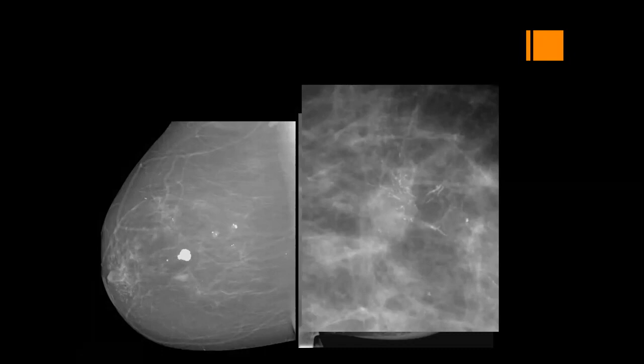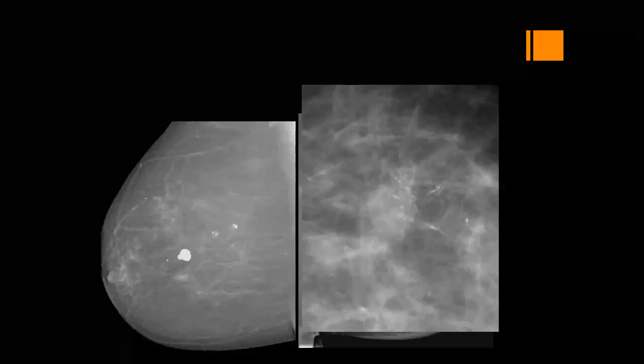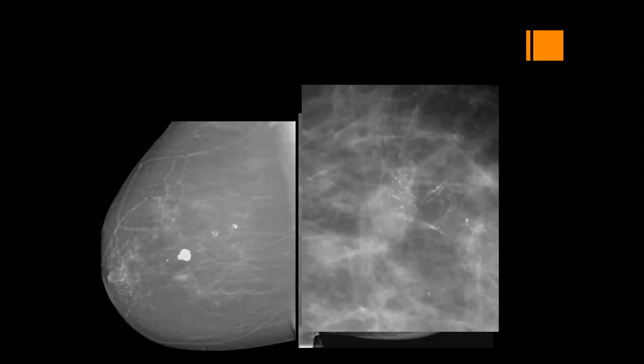Why 4C? If you see this type of calcification alone, it is one thing, but if you see this type of calcification associated with an indistinct mass and diffuse edema, it will be BI-RADS 5. Now five.